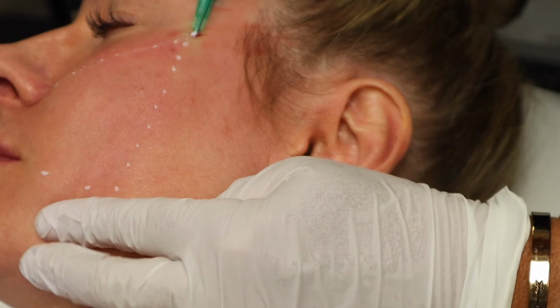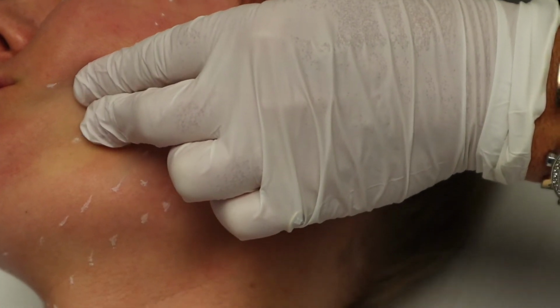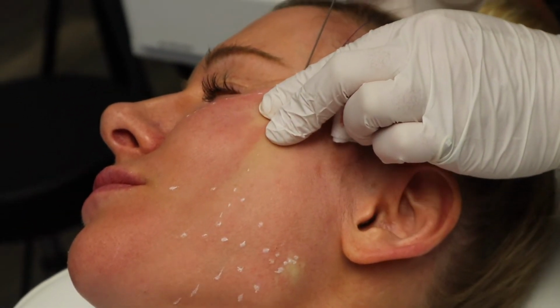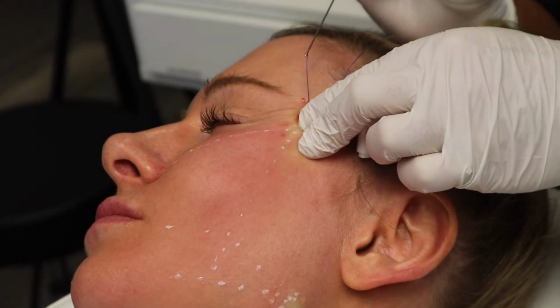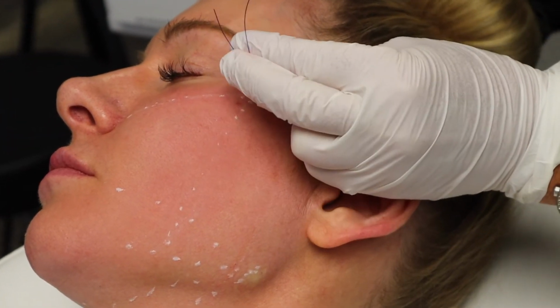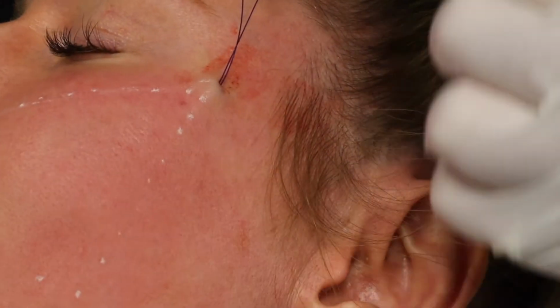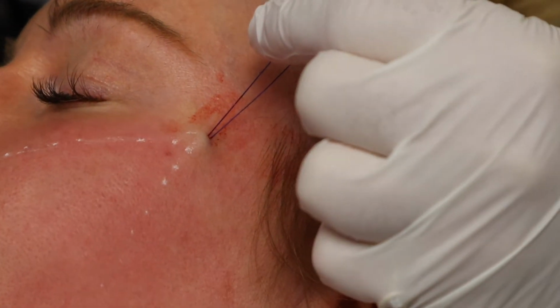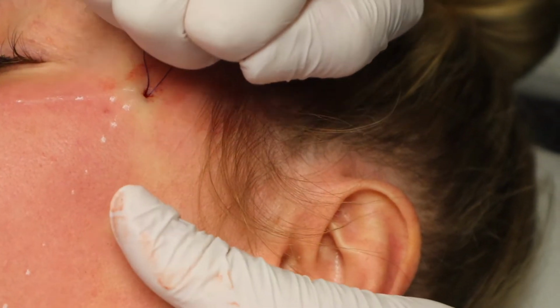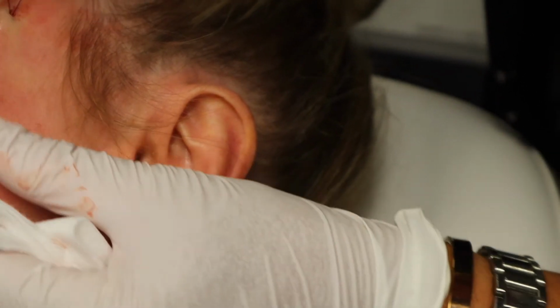Here we see a second thread being inserted through the same insertion spot, and this massage upward helps ensure that the barbs along the thread are securely in place. And then we can give the threads a nice tug, making sure that they're secure. If there's any indication that the thread might be placed too superficially, we can adjust it a little bit by pulling on the end.